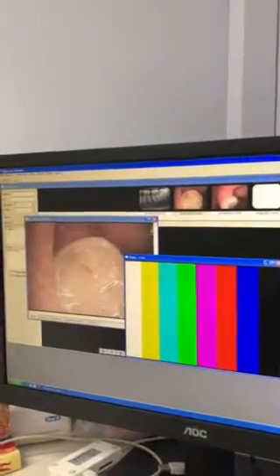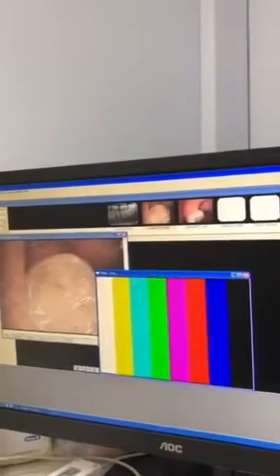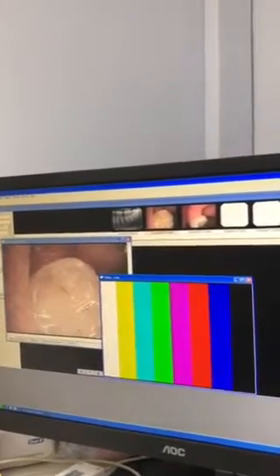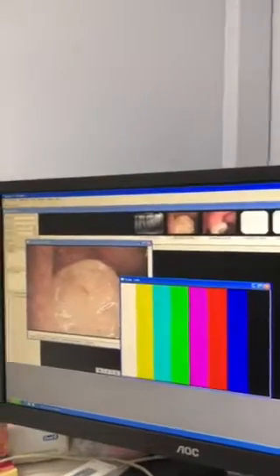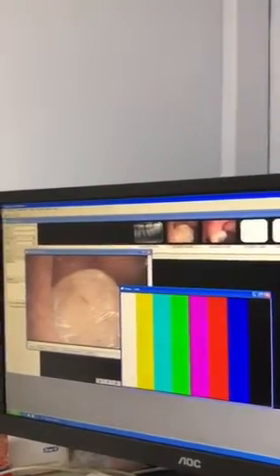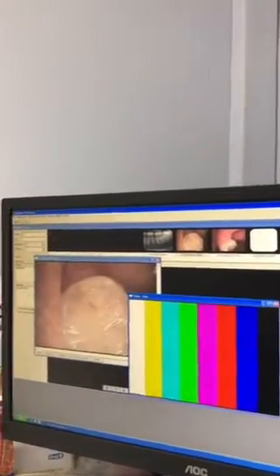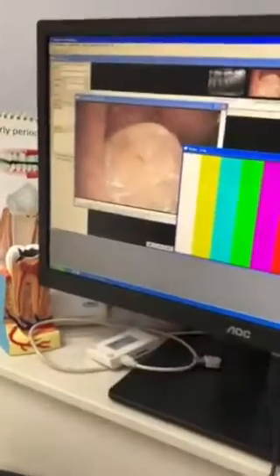And then you've got the OPG, which is the X-ray that goes all the way around the teeth, and then CT scans, which can be employed for checking various bits of pathology that might be present in the mouth, assessing wisdom teeth, assessing sometimes root treated teeth, and planning implant cases.